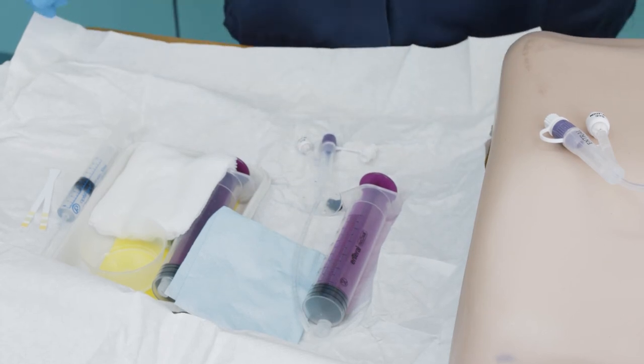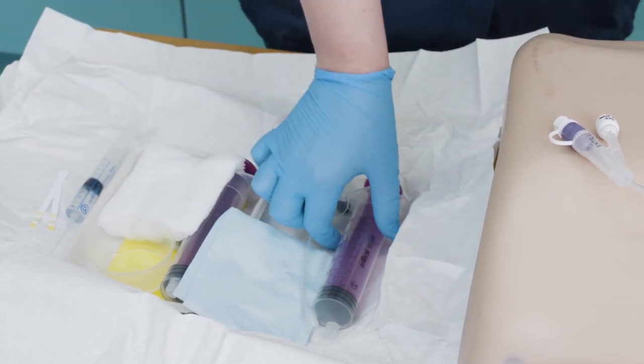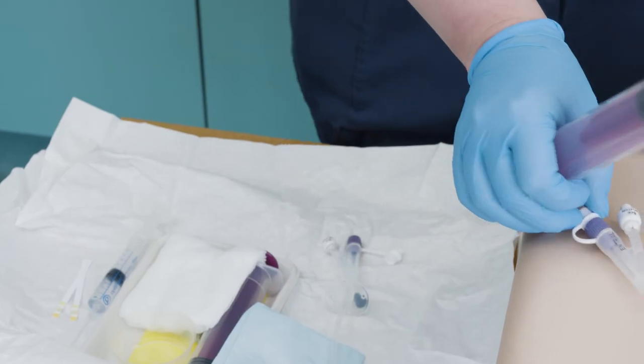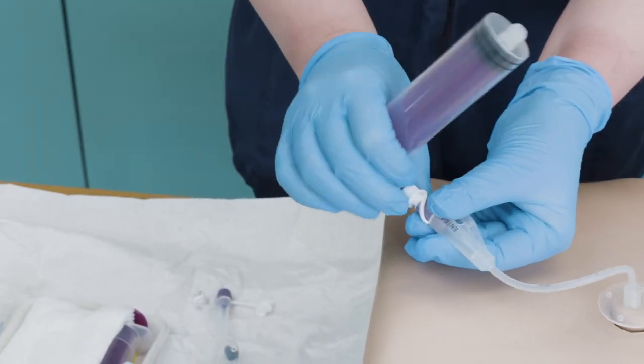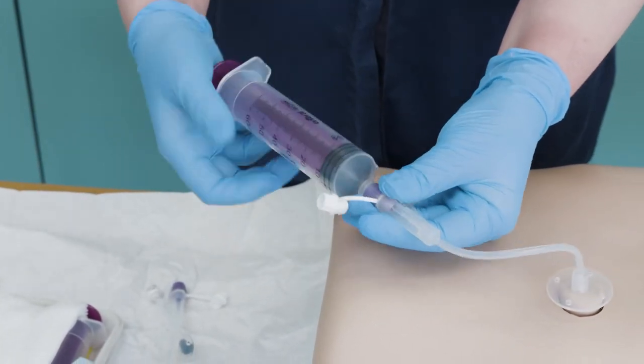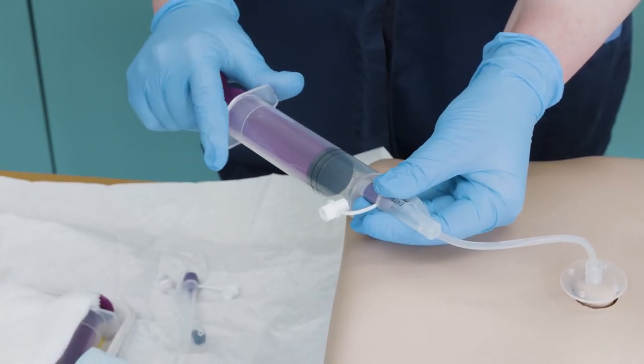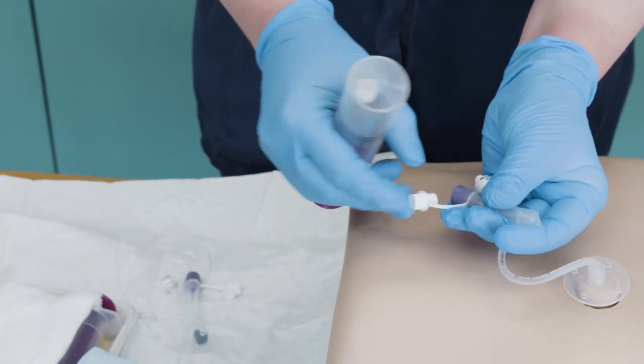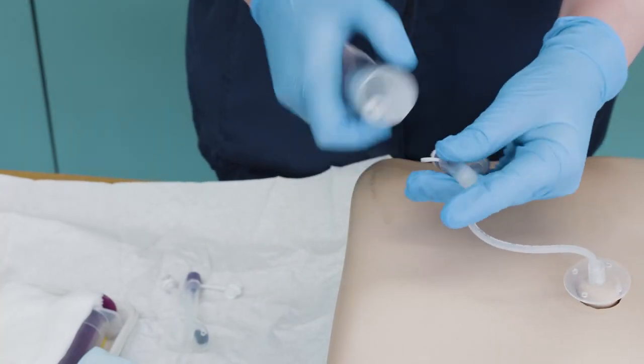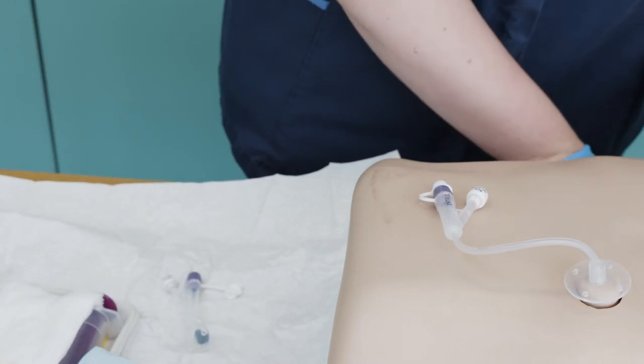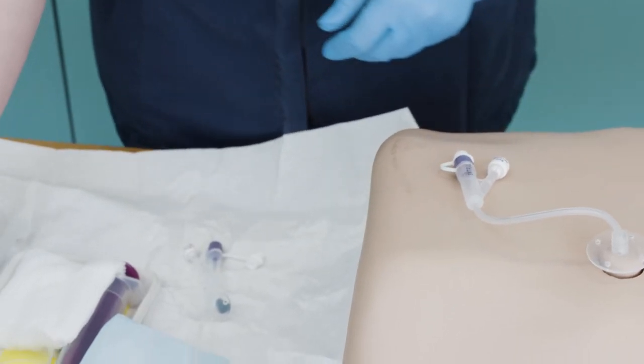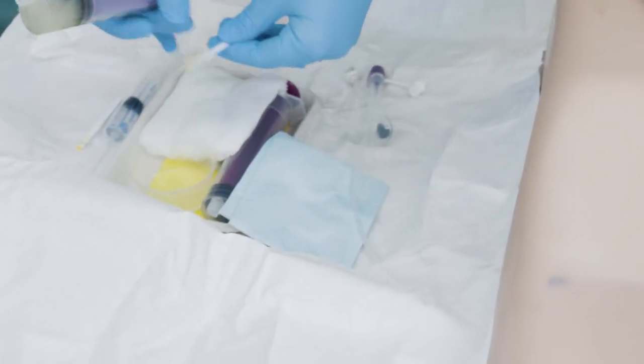If the existing tube is still in place, use a 60ml enteral Enfit syringe to test the position of the gastrostomy tube by aspirating gastric fluid and testing that it is 5.5 or below on CE marked pH paper. Remember to wait the recommended time as stated on the pH paper instructions.